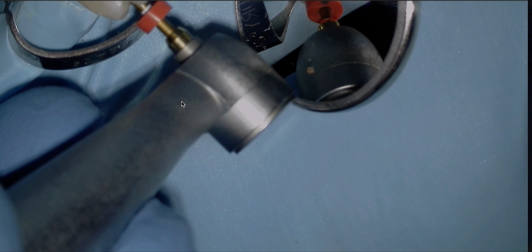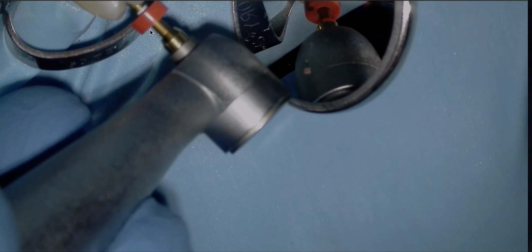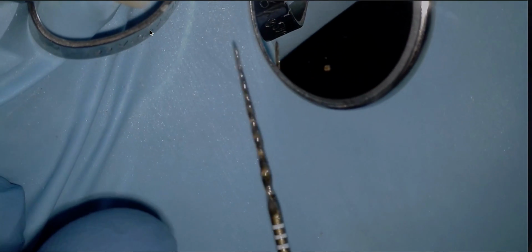And right there you can see, so now I'm using the Wave 1 Gold medium. I've skipped the other process, and I wanted to get to this point. This file is not progressing to my working length. You can see it's cutting in the apical third, but it's not going anywhere. We've hit the end of the road.